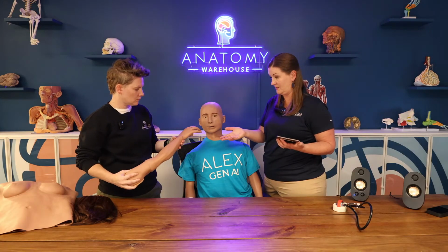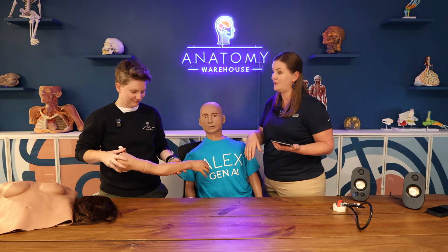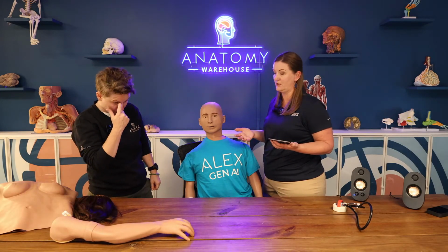They can do that on their own. And then there's also an injection site in the shoulder as well. I can feel that. Yeah, they can absolutely do injections too. So Alex can be an even more well-rounded simulator for different clinical practice.